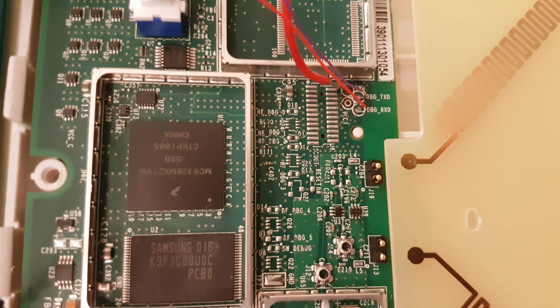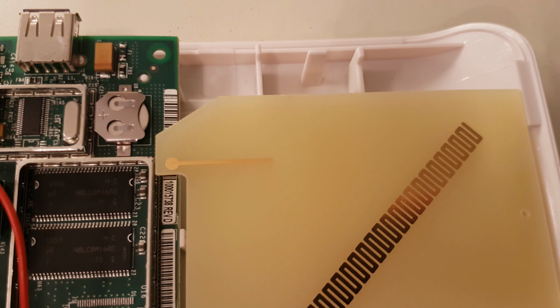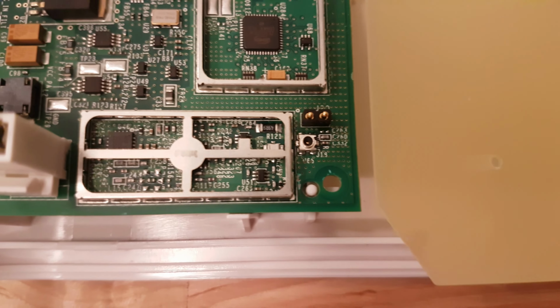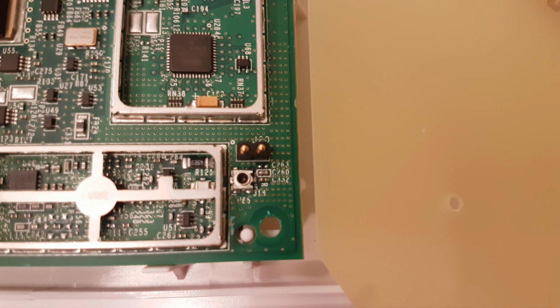It communicates over RF. The antennas are here. And actually, there are two different types of antennas. Up here, you can see the shorter one. That's actually a 2.4 gigahertz antenna, and the transceiver for that is here. And then here is the antenna connector for that 2.4 gigahertz antenna.